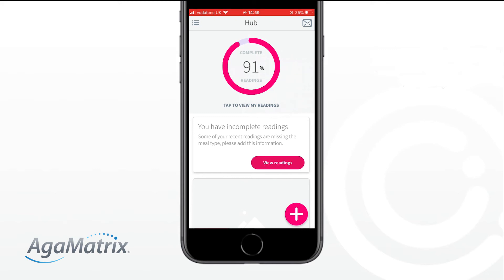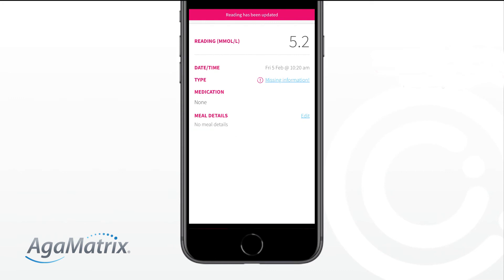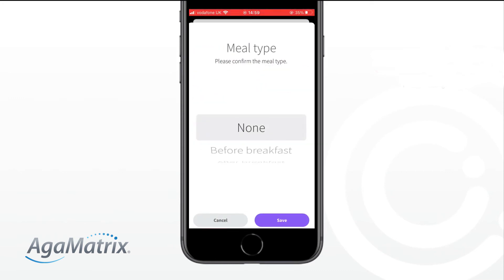Tap on this alert to view readings. Here you will see all of your results listed, starting with most recent first. Tap on any results which have an alert stating Missing meal type information and complete any missing information.